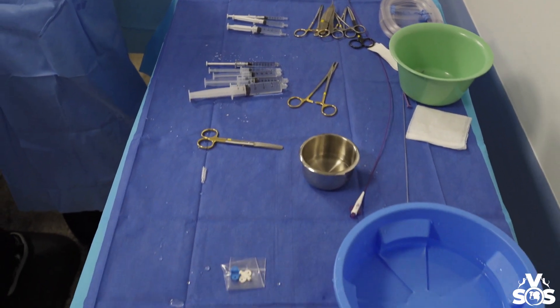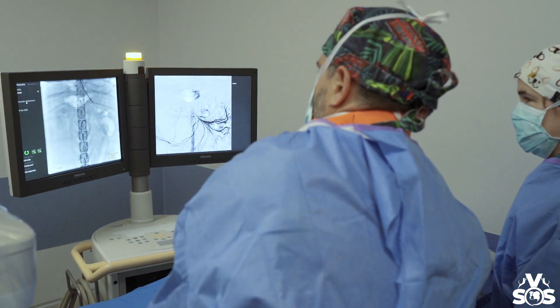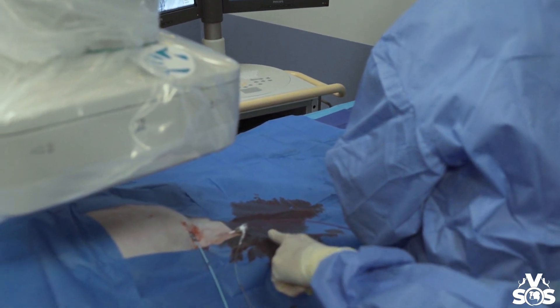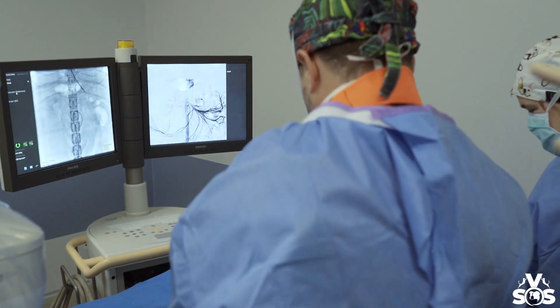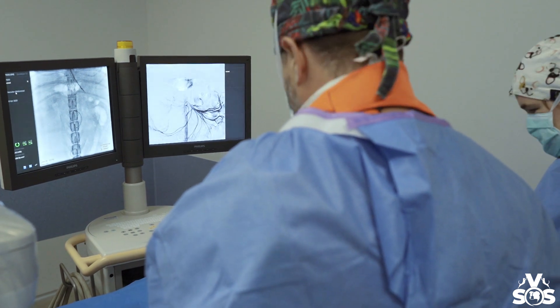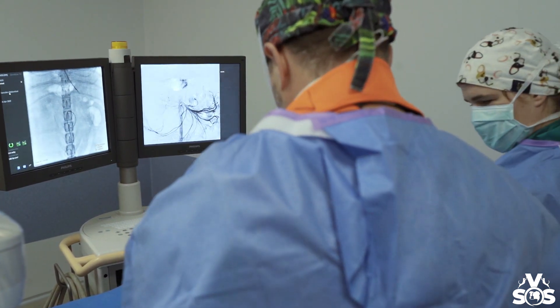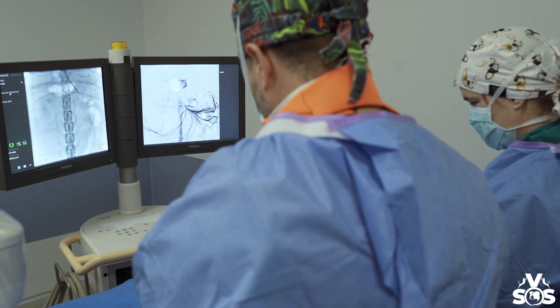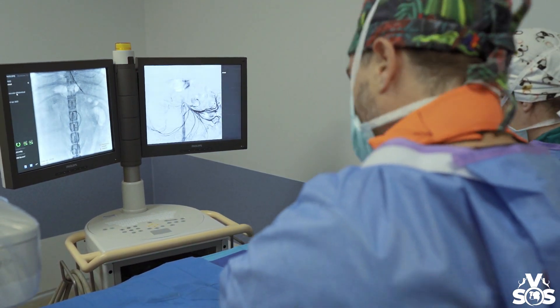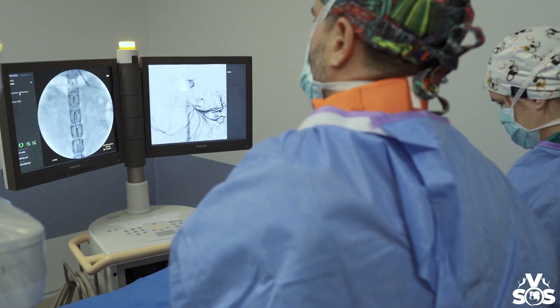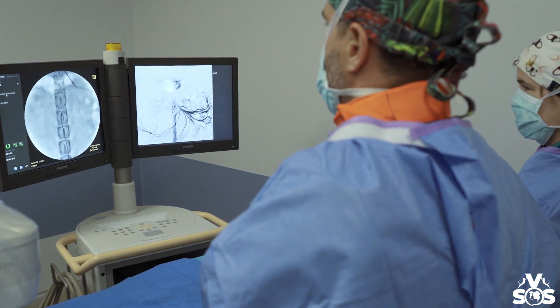We've got a little microcatheter — a tiny microcatheter — inside the bigger catheter. David is driving the small wire using the map on the right screen to see which artery he's trying to get into. The ultimate aim is to get into the artery feeding the big tumour and then deliver an embolic agent, meaning we'll try to embolize or stop blood flow — either slow it down or stop it, depending on where we think it's going. Once we get into that area, we'll inject more contrast, see where it's going, and make a decision.